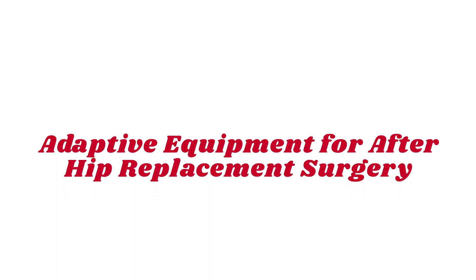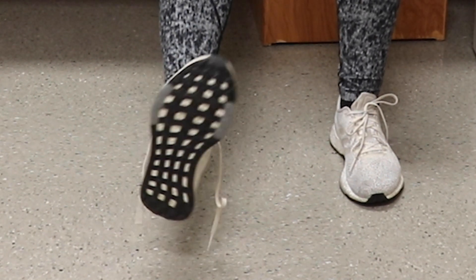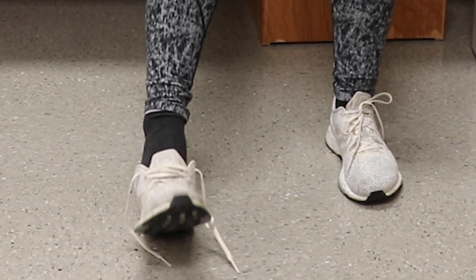The following equipment will help you after joint replacement surgery. It may be difficult to put on your shoes and socks after surgery. If you don't have someone to assist you with this, you can use a sock aid and a long handle reacher.